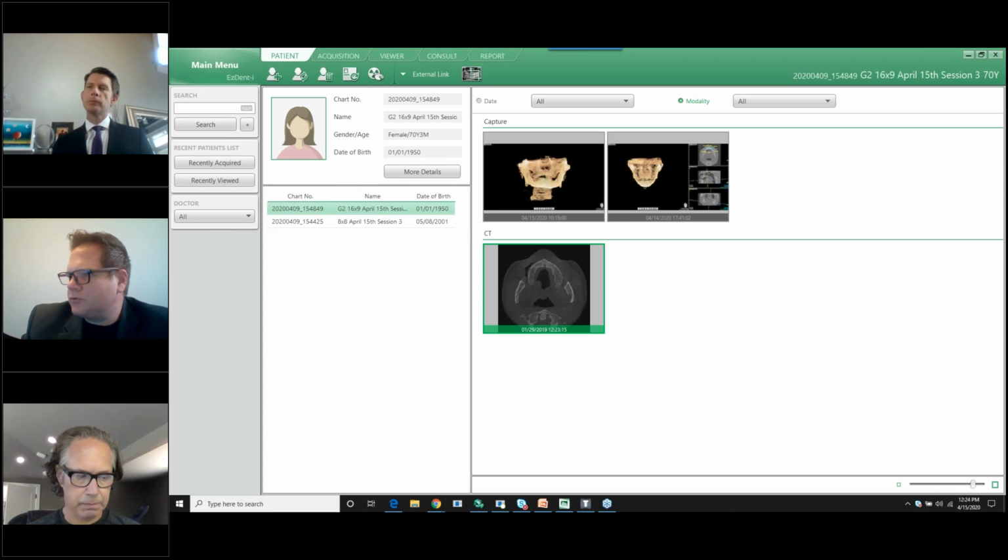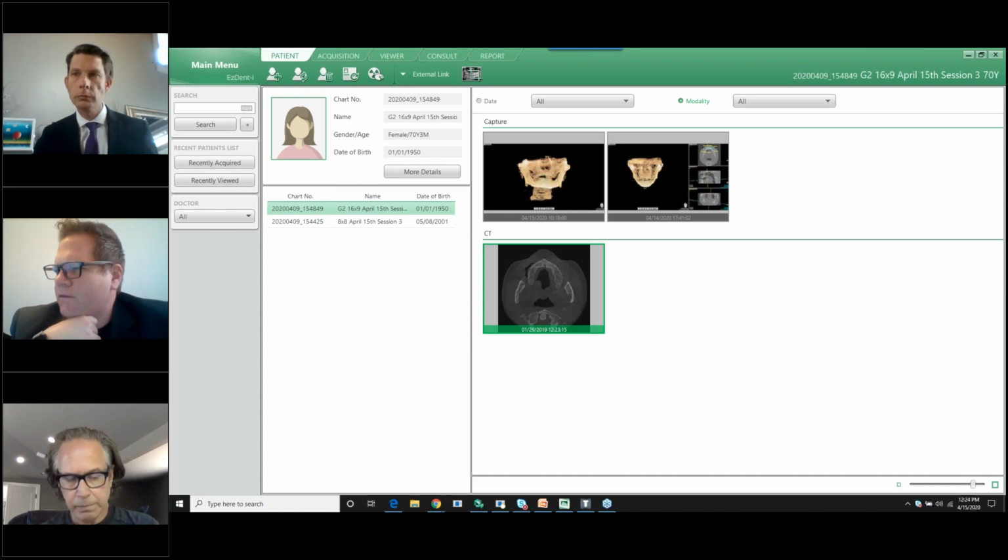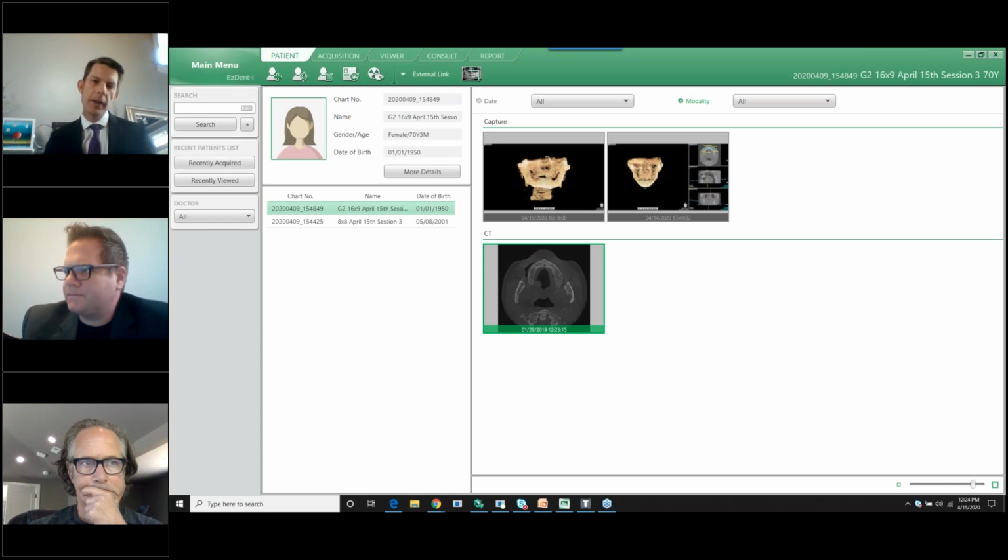Okay. Somebody's asking why the measurements are taken between the lines drawn on that section tab, the anterior aspect of the implants for anteriors and the distal aspect for posteriors. I think they're referring to the AP spread, and I think we've covered our AP spread. Dr. Engel, you covered that before.